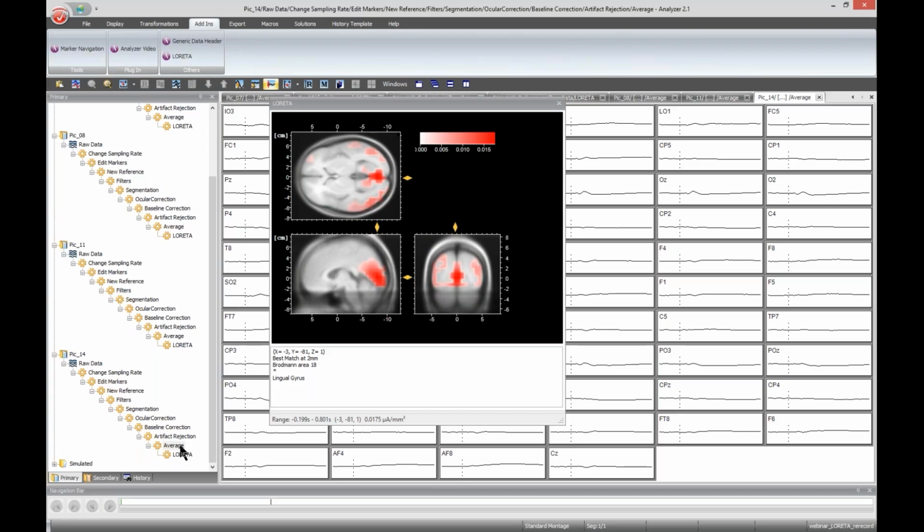Now moving on to the second question: how many trials are necessary for a valid source localization? Isn't 800, as in your example, a really large number? Theoretically, the more segments you have before averaging, the better the chance to get an increase in signal-to-noise ratio. Therefore, it's good to have as many segments as possible. But so far, I'm not aware of a golden rule pointing to a certain amount of trials to achieve reasonable signal-to-noise ratio for a valid source localization. At this point, I would suggest you check the literature related to your research area.